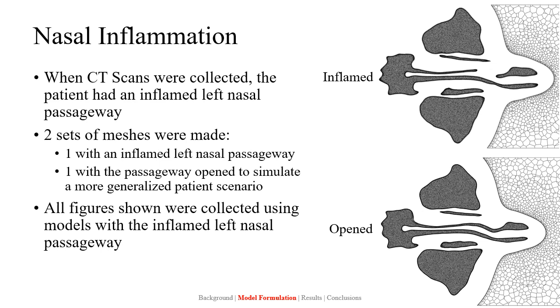All figures shown were collected using models with the inflamed left nasal passageway. However, CO2 metrics will be included at the end that were collected with the opened nasal passageway, and they will be compared to the inflamed.